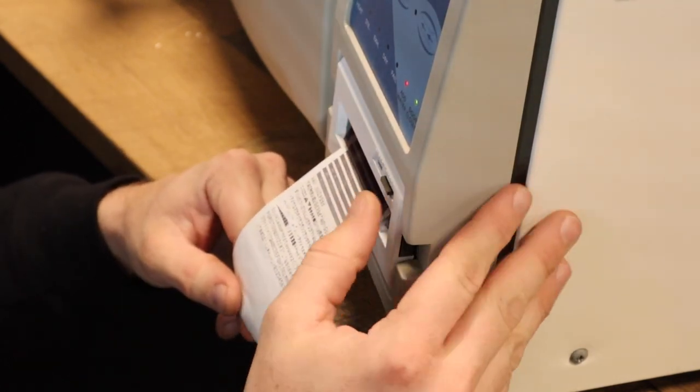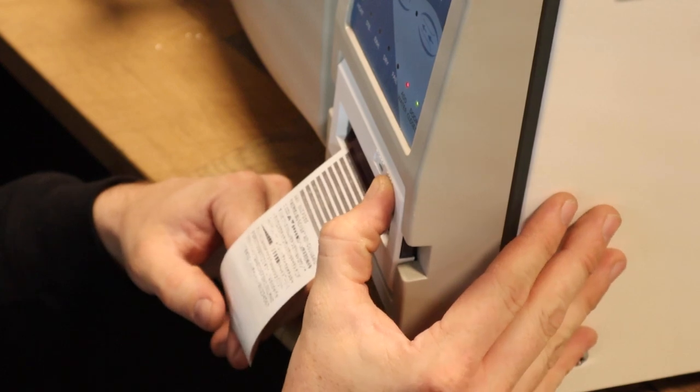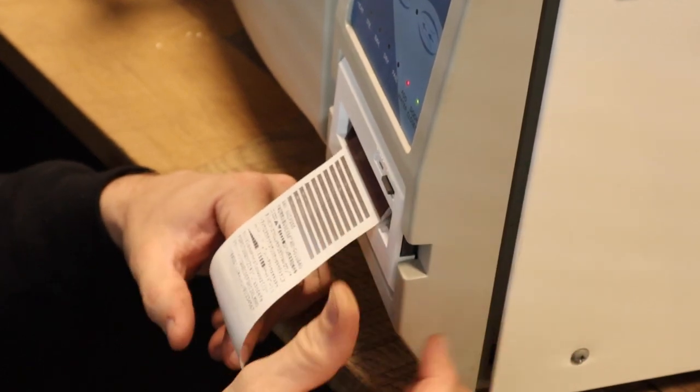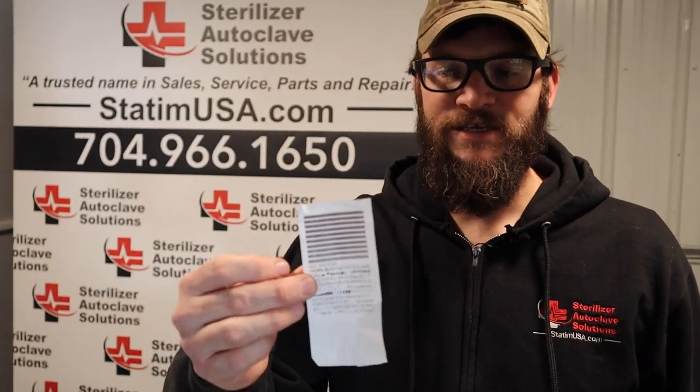Once the paper has gone through its test print, I'm just going to press that button and let it roll out a little bit more. This will ensure the printer is working correctly. That is how you do a paper change and a printer test on an EZ10 or EZ9. The printout will look something like this.